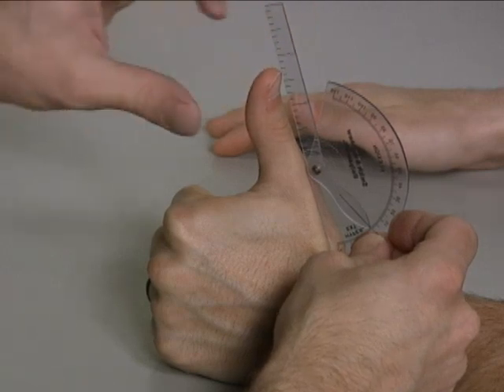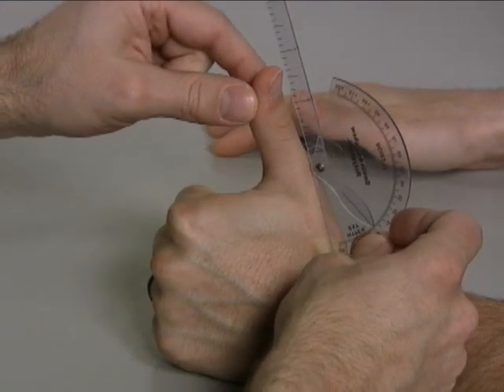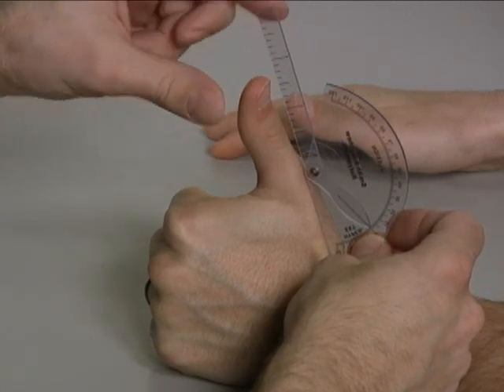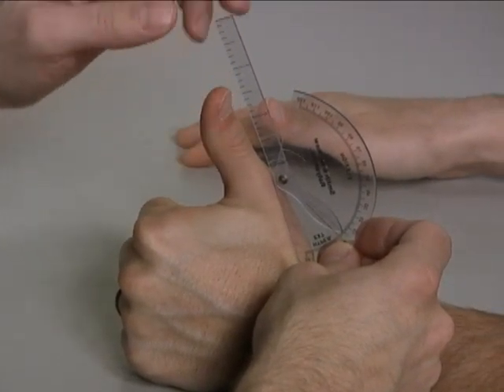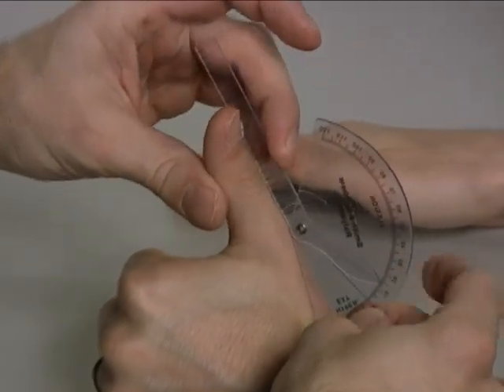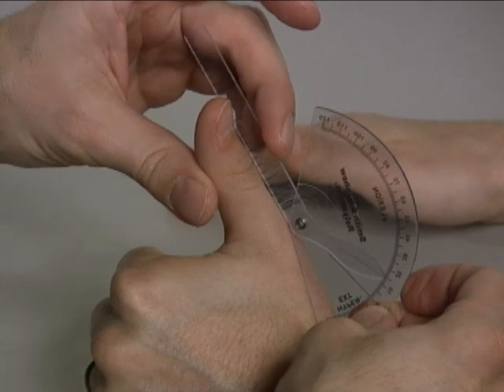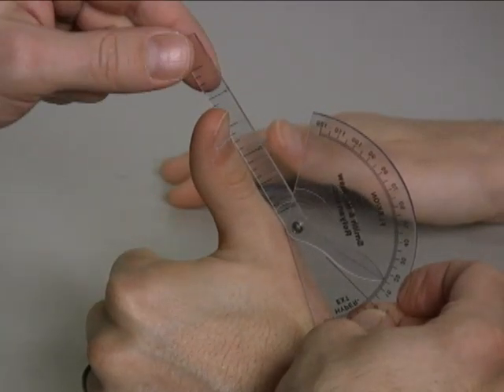Notice that if I just put it straight out, I'm going to bridge both the MP and the IP joints, and that's not going to give me true measurements. So since most people have a fair amount of IP joint hyperextension, you're going to have to run it to the side. That way you can see the amount of extension they truly have at the MP joint.